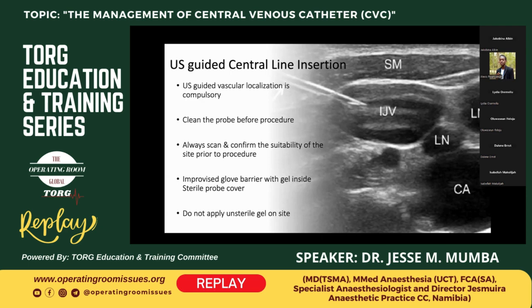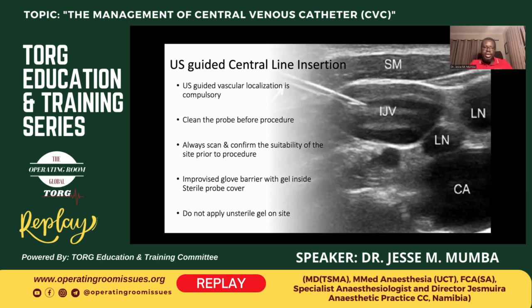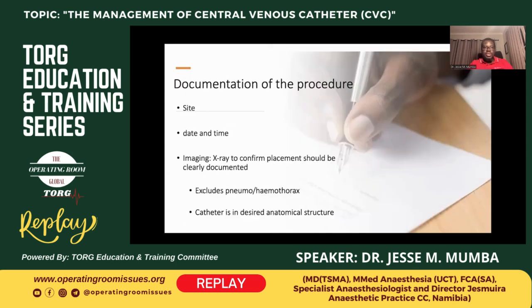You need to add some gel within the sterile drape, and also the gel between the probe and the patient. And you always have to use sterile gels when you have done the draping and you are ready to use the ultrasound. Lastly, but not the least, it's always good to clean off your probe before you put it away, because the next person may need to use it, and in an emergency they may forget. But just be in the habit of cleaning all your instruments once you use them.